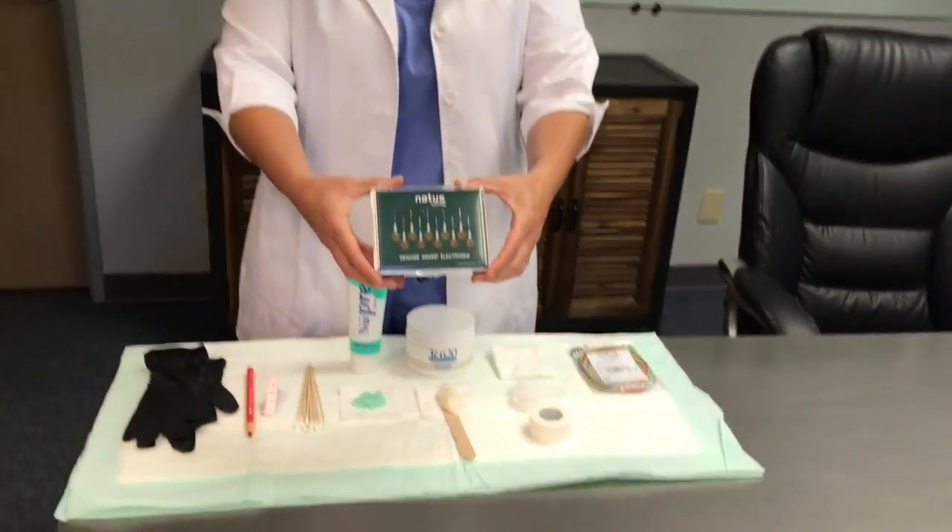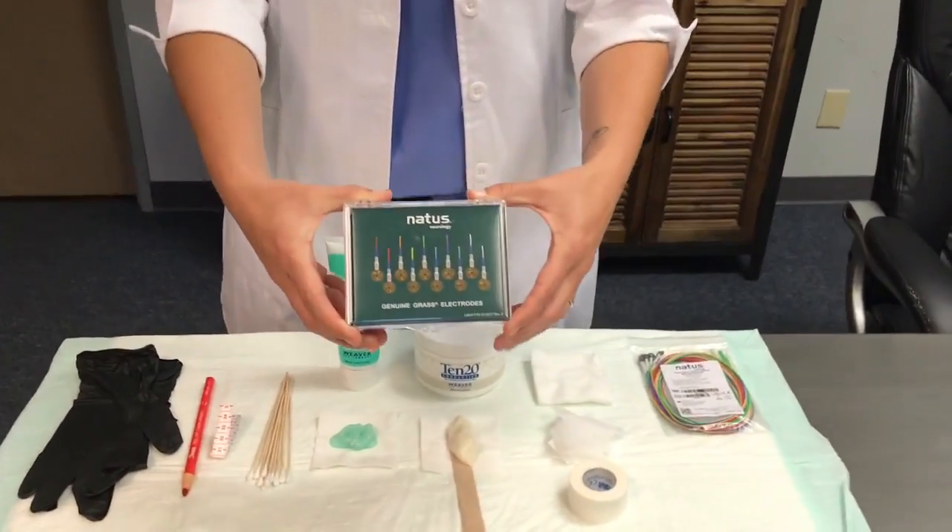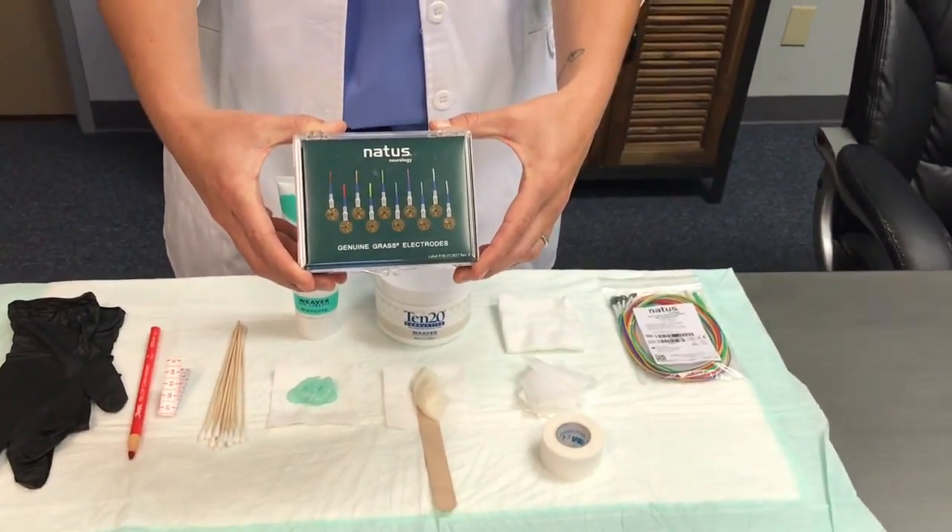First, I will discuss EEG cup electrodes. The choice of electrodes is up to the facility. I recommend two options. If you prefer a reusable cup electrode, the Genuine Grass Gold Cup Line is an excellent choice. For many years, this product has been the industry gold standard.